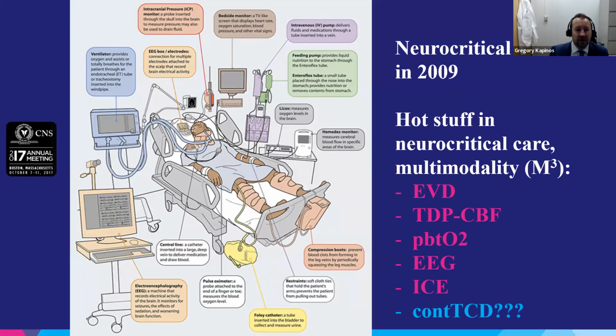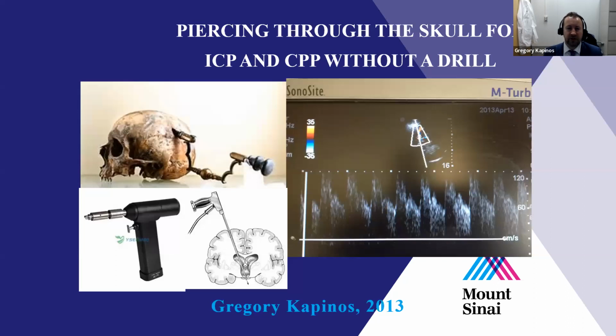So that tells you a lot that even in 2009, the majority of neurocritical care training and the premier training programs in the nation were only seldomly exposing the fellows to the value of transcranial Doppler. And in neurosurgery, there has been, of course, 30 years of publications on the use of transcranial Doppler. But compared to drilling and measuring the pressure in the skull with a probe or a ventricular device, that has always been regarded, at least in the United States, I would say, as less valuable, less accurate, especially because at that time in the 90s, the transcranial Dopplers were not continuous. Obviously, it was not even meeting the criteria for a true monitor, since it was not giving you the ICP on a beat-to-beat, second-by-second fashion.